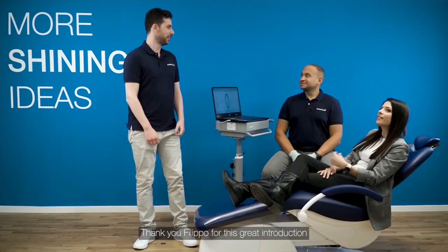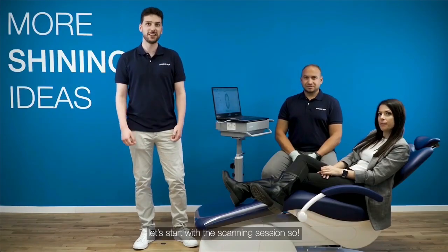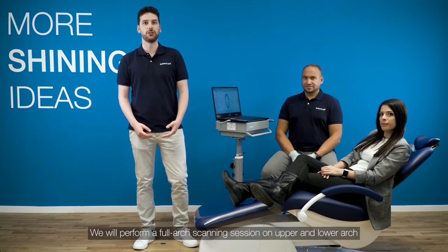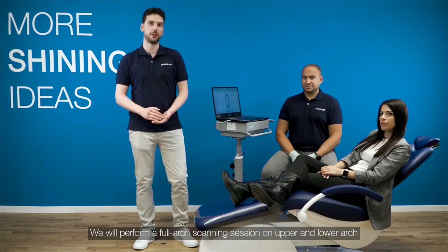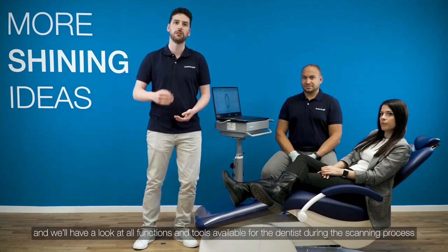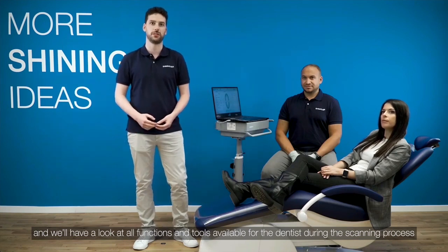Thank you, Filippo, for this great introduction. Let's start with the scanning session. We will perform a full arch scanning session on upper and lower arch, and we'll have a look at all the functions and tools available for the dentist during the scanning process. Let's go!